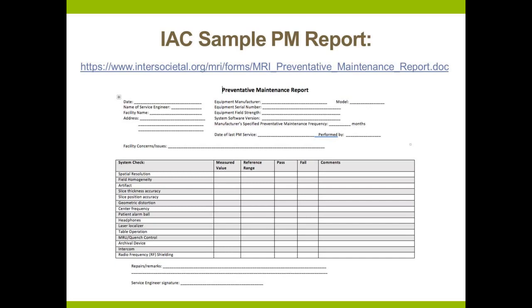And it's up to you whether you simply use this thing as a guide or whether you staple a page like this to the front of the stack and fill it out yourself and say, well, the attached supporting documentation, here's the summary, right? I know nobody has time to sit down and recopy information from paperwork you already have. This is really a tool to make your life easier, especially when you're collecting your documentation for an accreditation submission or a renewal, to be able to say, okay, I know that I've got everything that the IAC is going to be looking for when I submit this package.